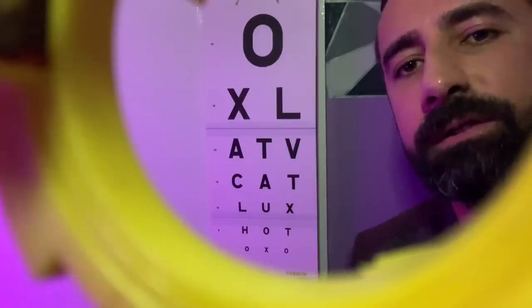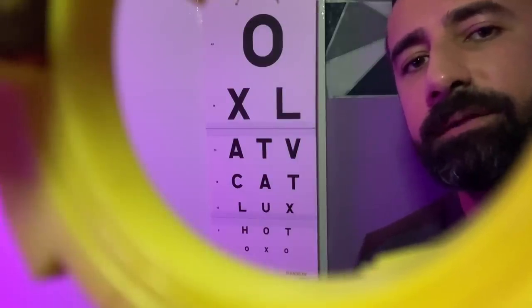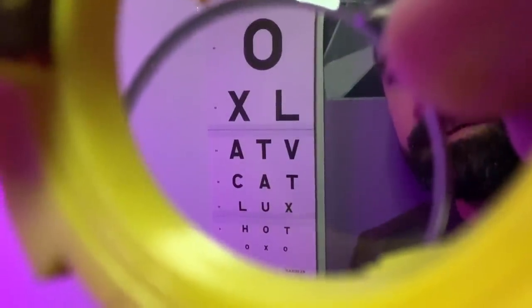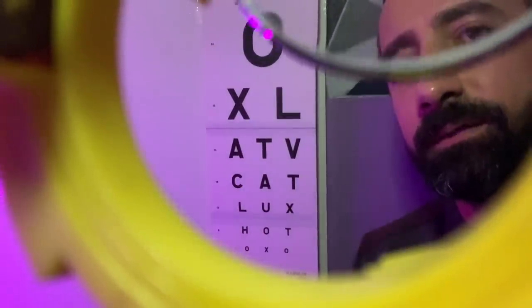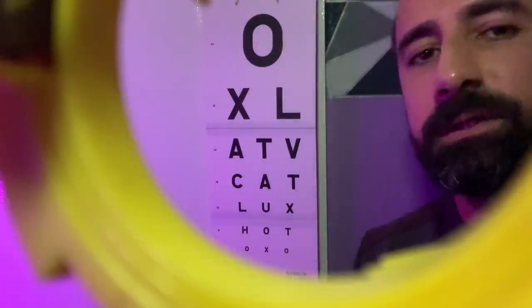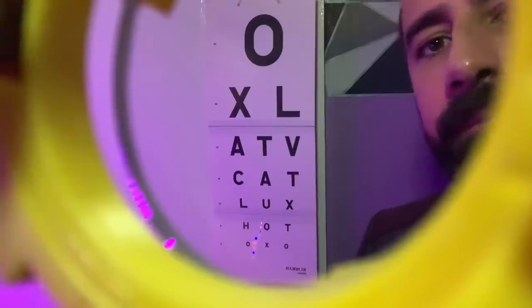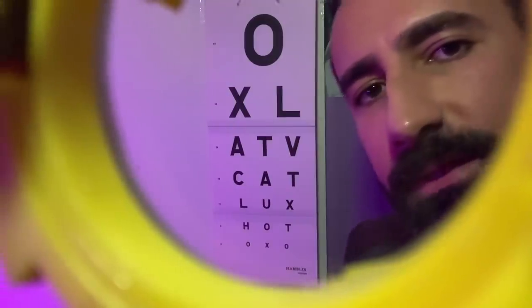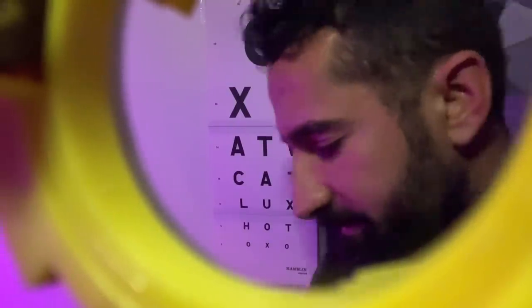Okay, let's try some different powered lens. Is the smallest row you can see clear with the lens, or without? Without. Okay, I'll place that lens in if it's a little bit clearer. There we go. Excellent. Let's just pop it in. There. Excellent. Is that a little bit sharper with the lens in place? Excellent.